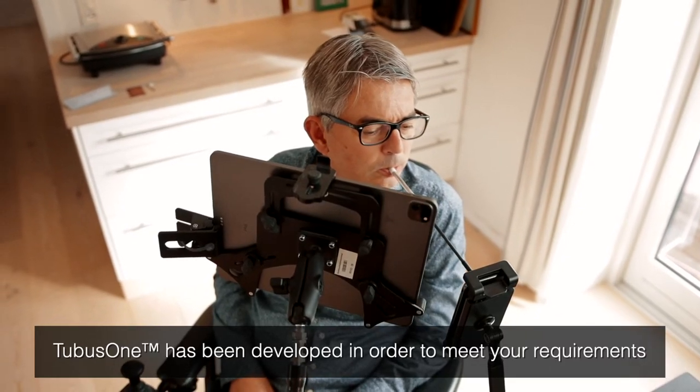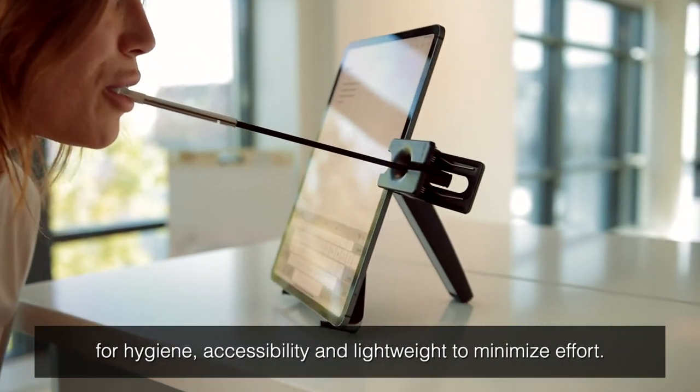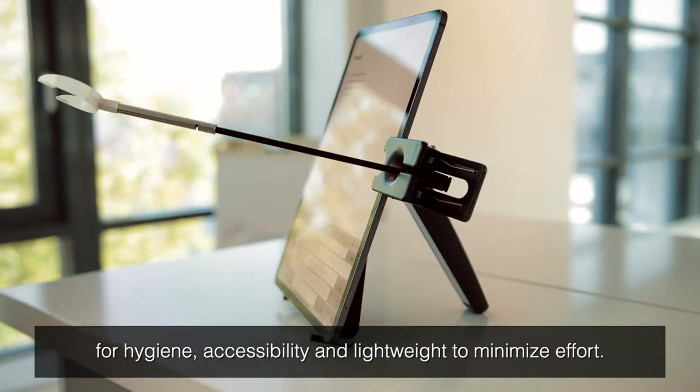Tubus One has been developed in order to meet your requirements for hygiene, accessibility, and light weight to minimize effort.